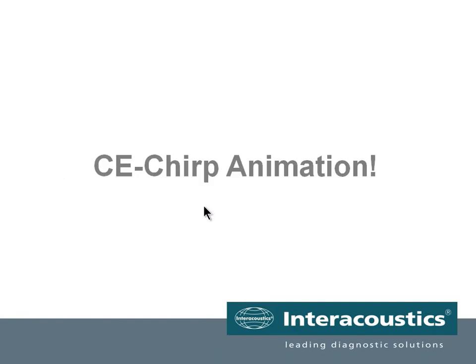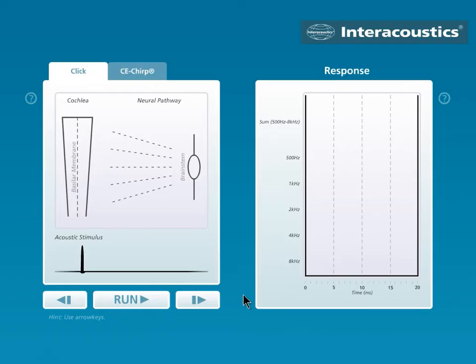Here comes an animation of the CE-Chirp to show you how it actually works in the ear and in the auditory neural pathway. In this animation, we have on this side our cochlea with the basilar membrane, and then we have the neural system, or part of the neural system, that leads to the brainstem. And we have the acoustic stimulus down here that we can put into the cochlea. Over on this side, we have the responses.